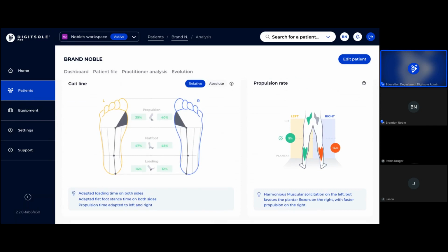This is really common, Robin. Oftentimes with people with low back pain, we also see this in older adults in general or sedentary populations, he does not want to engage on that right side and with his hip flexors, because pulling on that right hip flexor for stabilization is going to create more torque in that lower spine level. So he would rather create the propulsion into the swing phase with his plantar flexors, his calf muscles. That's commonly seen in patients with low back pain, for example.